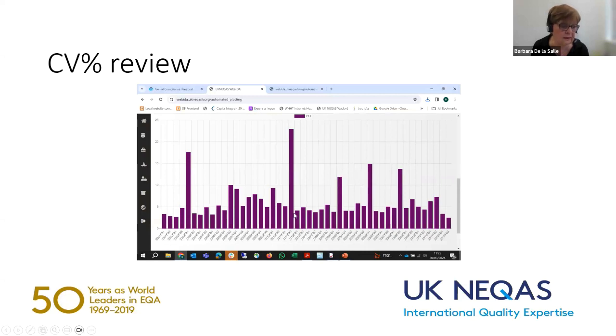However, if we would see a particular high CV and we can't explain it in-house, or we saw a particularly high CV across a number of parameters, we would look into that, and that is when we may withdraw the samples. We also will look to see whether there are any particular data points that need to be excluded, because although we trim our 10%, that may not be sufficient on occasion, and there may be a couple of participants who have not been trimmed out by that 10% trimming. We will go back, we will look, and we will trim more data out.